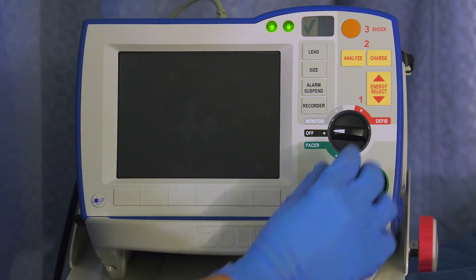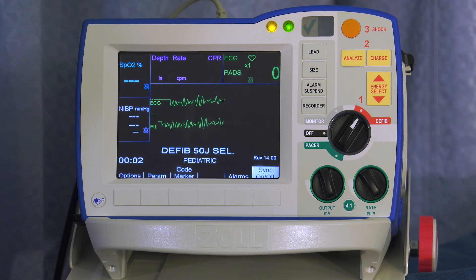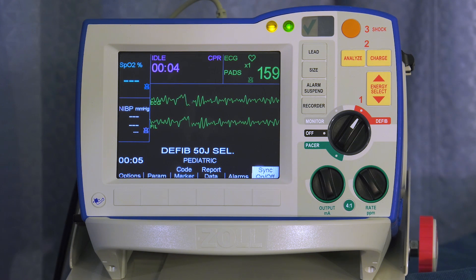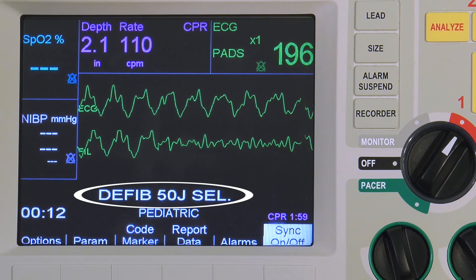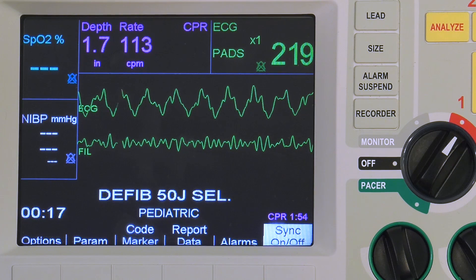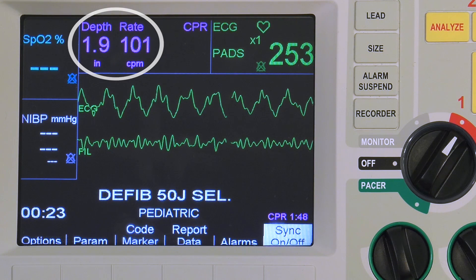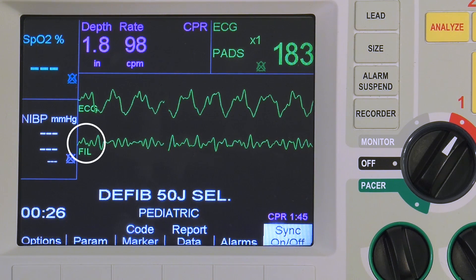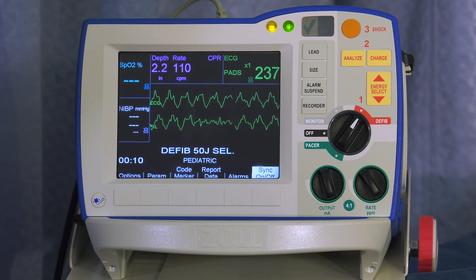For pediatric patients less than 8 years of age and less than 55 pounds or 25 kilograms, one-step pediatric CPR electrodes can be used to maximize the R series pediatric capabilities. When connected, the R series defibrillator will automatically lower the energy level to 50 joules, adjust its AED analysis algorithm to pediatric parameters, display compression rate and depth on the CPR dashboard, and filter compression artifact from the ECG waveform. Pediatric CPR electrodes do not enable real CPR voice prompts or any visual indication of ineffective CPR.